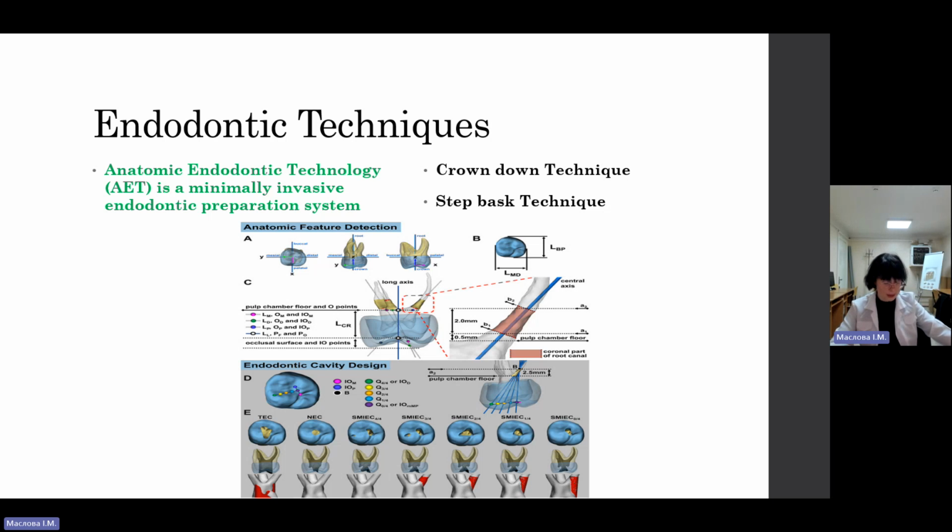Within these specifications is embedded the idea of the hybrid concept. Depending on the individual root canal anatomy and the associated special difficulties, the root canal preparation must be carried out with a logical and reasonable instrument sequence, which ideally has been selected for the individual clinical situation. The hybrid concept has previously been published in parts.